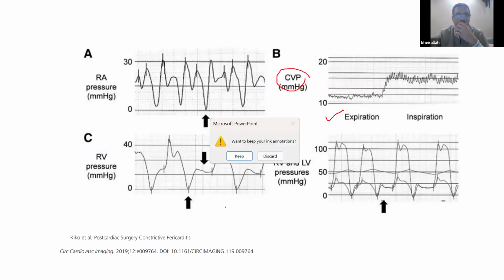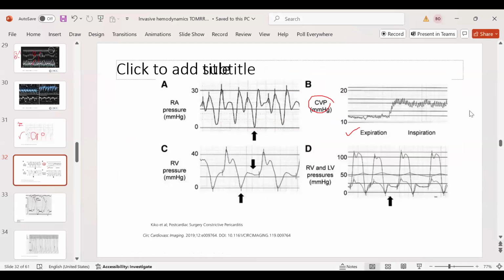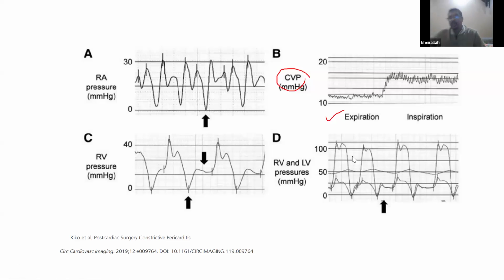What do you notice? Increase in pressure. Normal. Exactly. Increase during inspiration. Yes, inspiration. It's very important, sir.